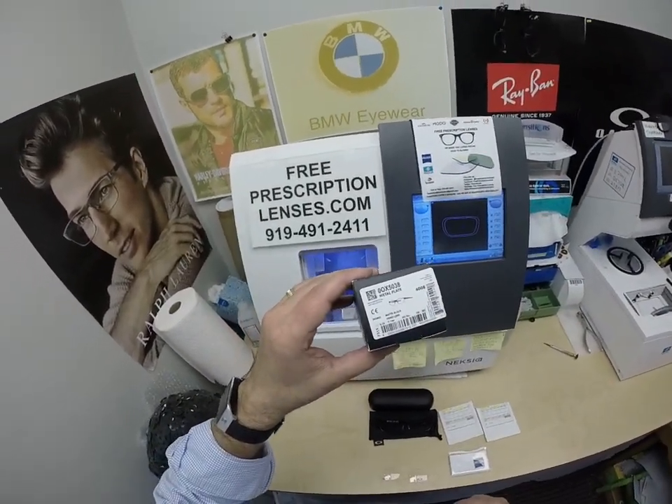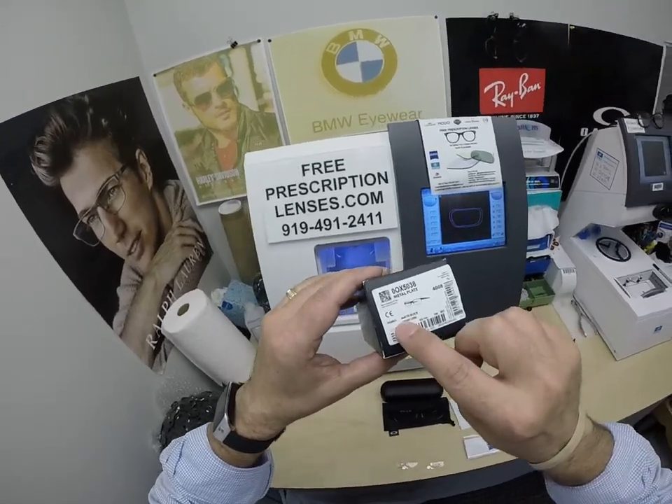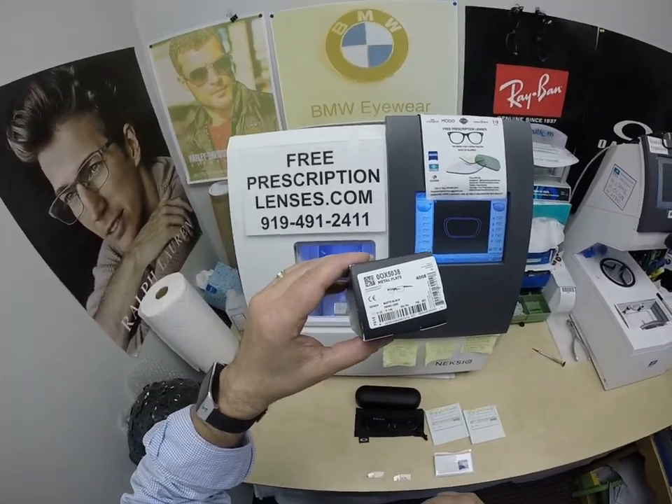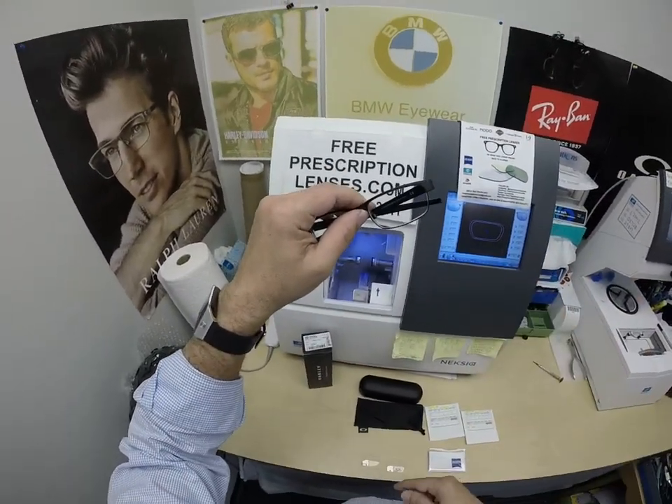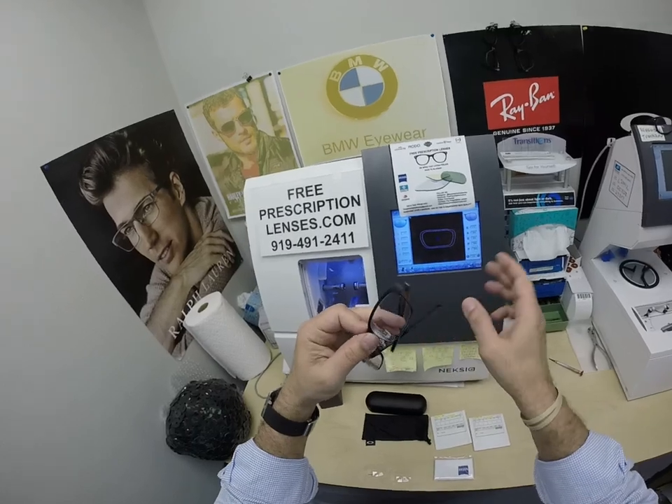I'll show everyone how I bring that loving feeling back to glasses when I show you Steve's Oakley 5038. This is the metal plate. He's getting it in color 05. It comes in about five colors and three sizes: 53, 55 — seen here — and the larger 57.